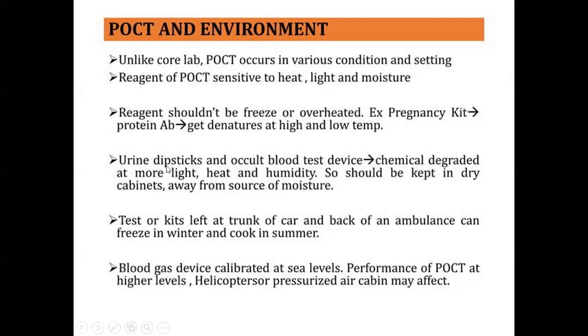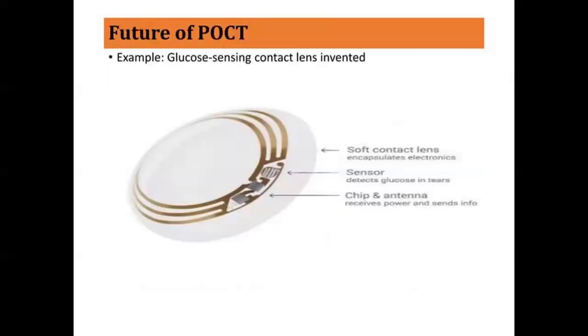And when you are using the dipstick method or even the strips, they should be kept away from light, humidity and moisture. If there is moisture present, there may be some fungal contamination. The contaminations may result in false positives or negatives, so that also has to be taken care of.